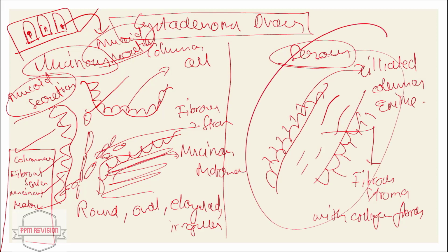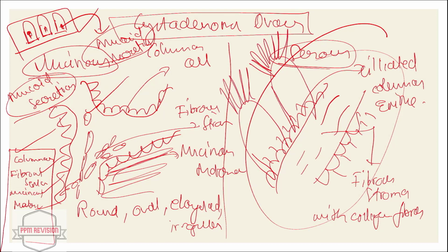Same thing when we compare with the serous type. In the serous type, numerous cystic spaces of various sizes are seen. The cystic spaces are lined by tall columnar ciliated epithelial cells. So this diagram, hopefully you remember. The epithelial cells have granular pink cytoplasm and central vesicular nuclei.